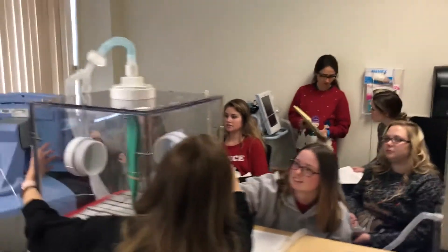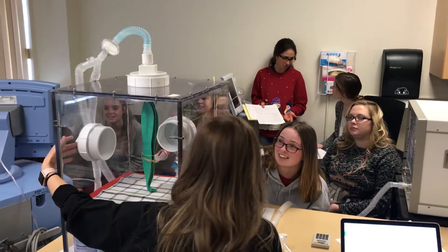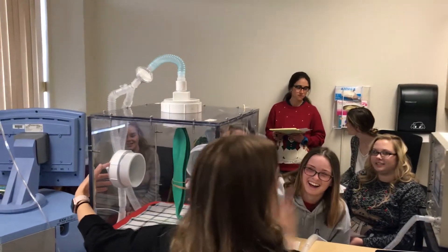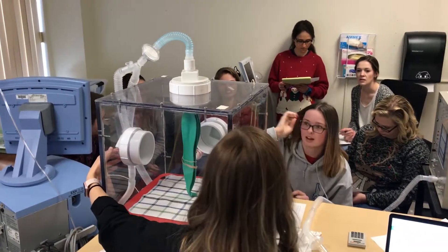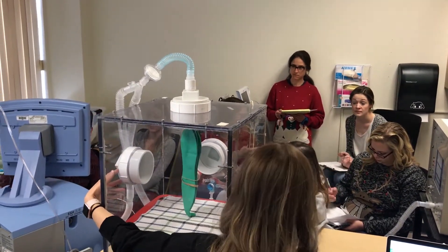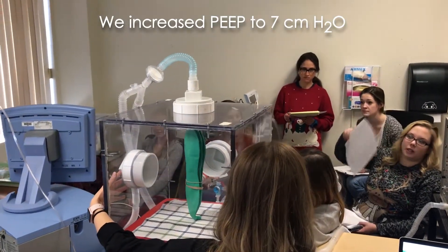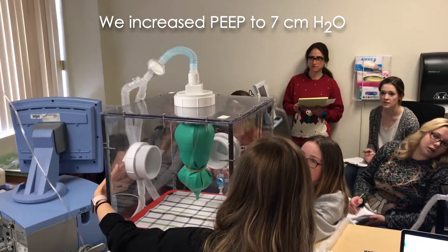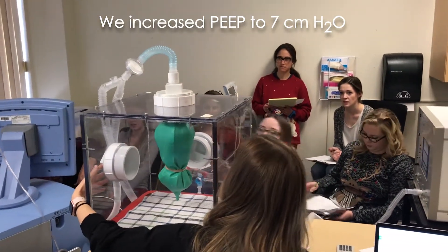Like if it goes, let it go, but don't let it fly out. So what is that pressure, Trevor? Seven. So what are we going to set our PEEP at to overcome the abdominal pressure? Maybe like eight. So try seven first — not that you were wrong, let's just try seven and see what it does. We're looking at the measured P. And what are we doing — look at that circuit disconnect.